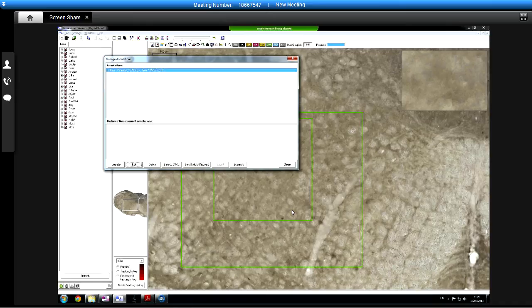Okay, so we've labelled that. That one's just disappeared because I deleted it. So the next stage is to click on the little one up here.